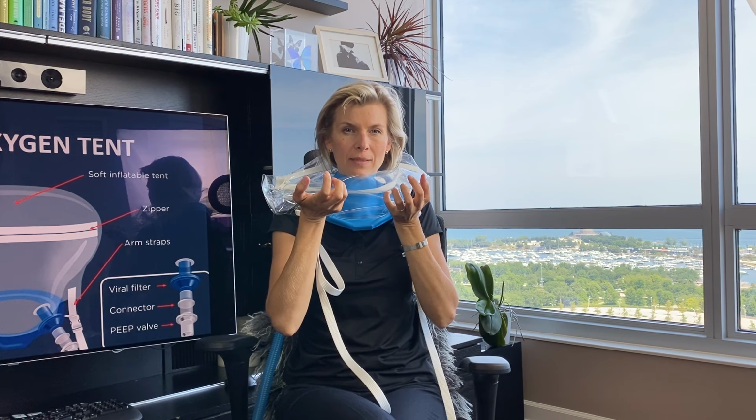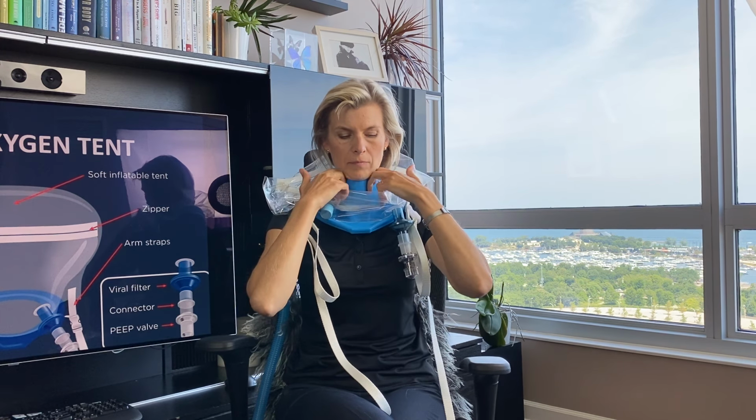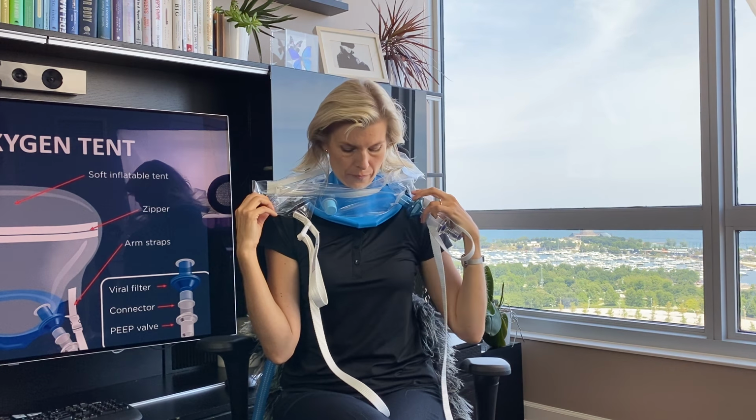Because when you're stretching the neck seal, there is nothing bumping into the patient's head, and if the patient has any tubing, nothing is going to get dislocated. So as you can see here, the neck seal feels comfortable, not too tight, and my neck is pretty small. It's 13 inches, so this is a very small size.